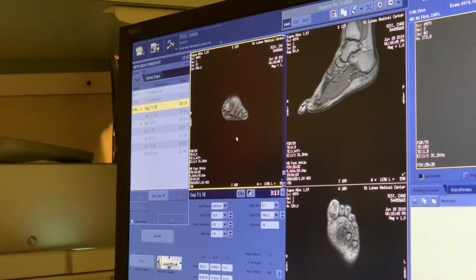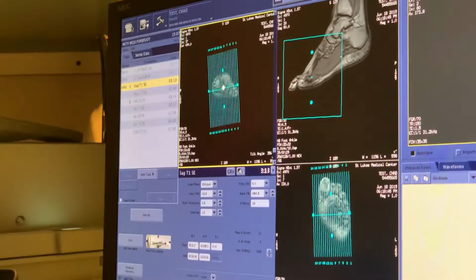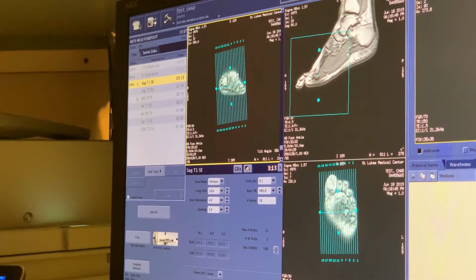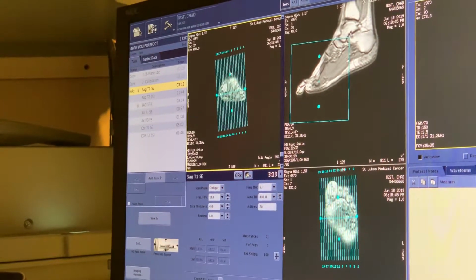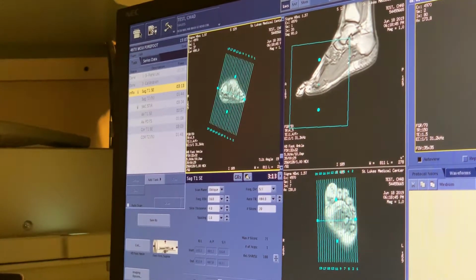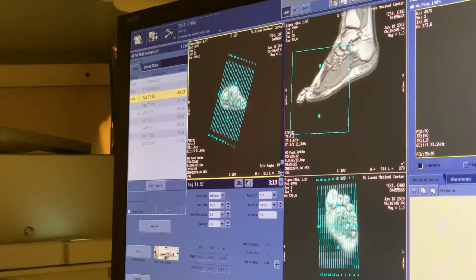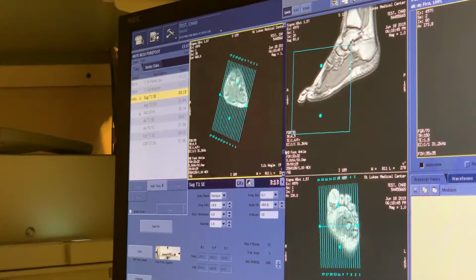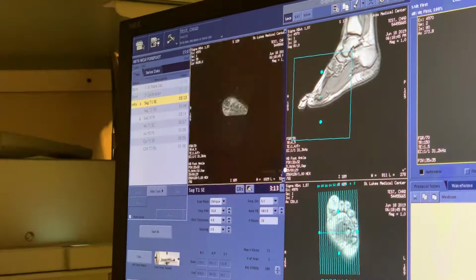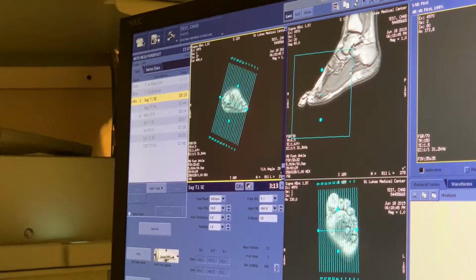Okay, so it's different. You don't want to make the mistake of scanning the forefoot and the hind foot the same way. So I'm going to angle, I threw down in the coronal plane. It's fine. And then what I do is I just want to angle about to this right here. So I'm going through all the metatarsals in about the mid-arch. I don't want to do it too high up on the arch, like right here, but I also don't want to do it down on the plane of the toes, which flattens out. So about mid-arch is where I want to angle with.